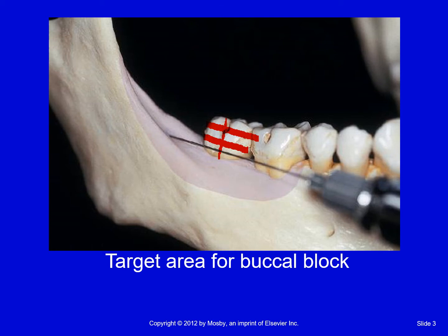So you may have the needle come buccally, and you want your needle to be parallel with the last molar that's in the mouth. These molars on the mandibular side are not always in a straight line, so you want to make your needle parallel to the very last molar, whichever that may be. It could be the wisdom tooth, it could be the second molar, it could be the first molar. Whatever's the last tooth, you make it parallel to that, and then you just go straight back. And you hit very quickly into this bone right here.